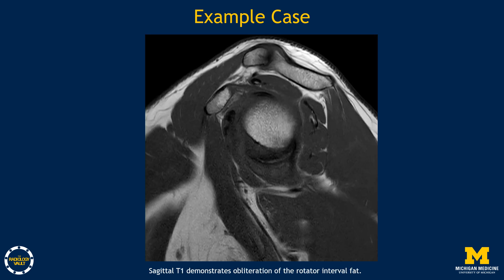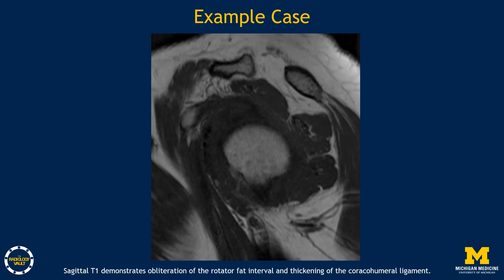This is another example case which shows obliteration of the rotator interval fat, as seen in the circled area. It is important to note that you don't need to have complete fatty obliteration of the rotator interval fat. However, a partially obliterated region of fat within the rotator interval may be enough to suggest adhesive capsulitis if there is a clinical suspicion for it. In this case, we have obliteration of the rotator interval fat and thickening of the coracohumeral ligament, with the arrow denoting thickening and indistinctness of the coracohumeral ligament and the circled area denoting fatty obliteration of the rotator interval.